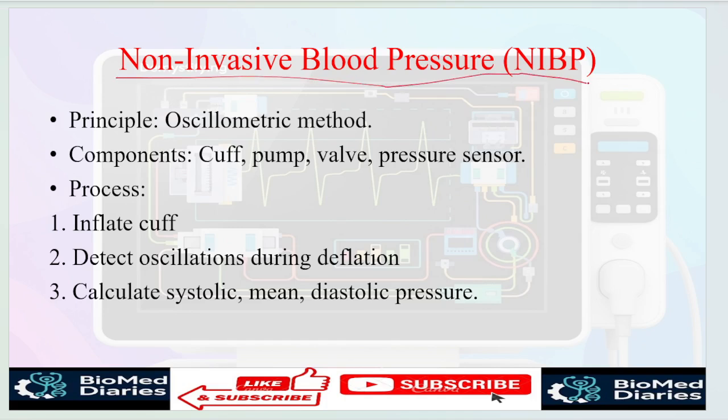Next, non-invasive blood pressure, NIBP. The NIBP method uses the oscillometry method, which is frequently asked in MCQ questions. The components of NIBP are cuff, pump, valve, and pressure sensors. The process involved is inflate the cuff, then deflate, detect oscillations during deflation, and calculate systolic, mean and diastolic pressure.